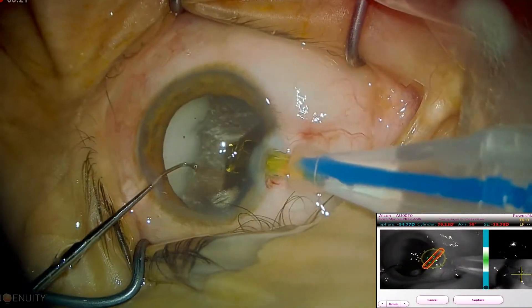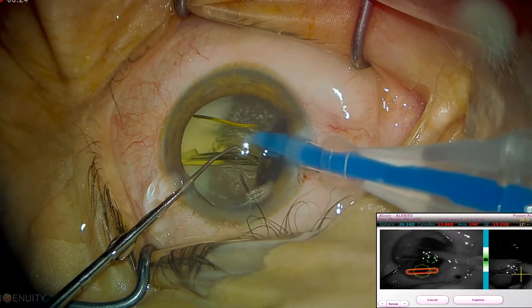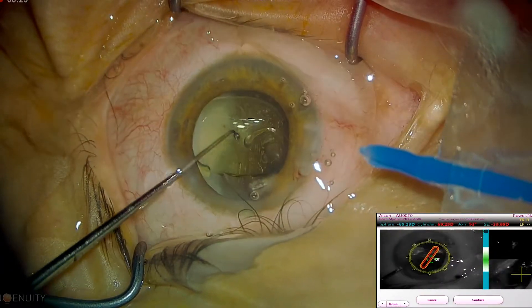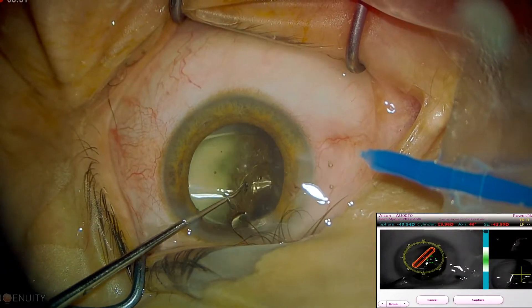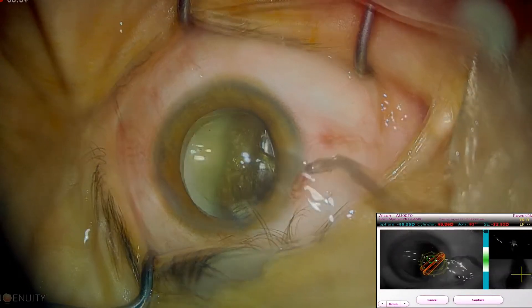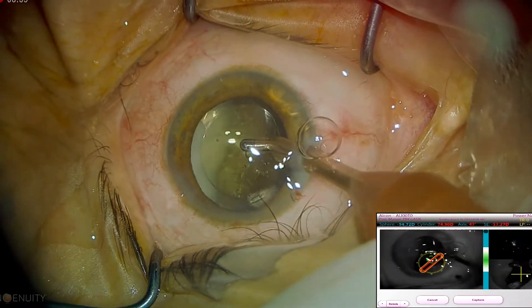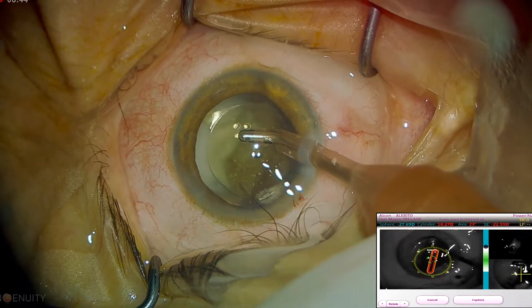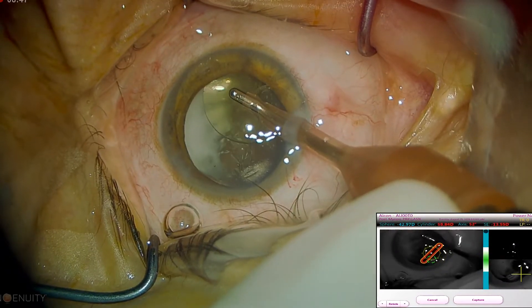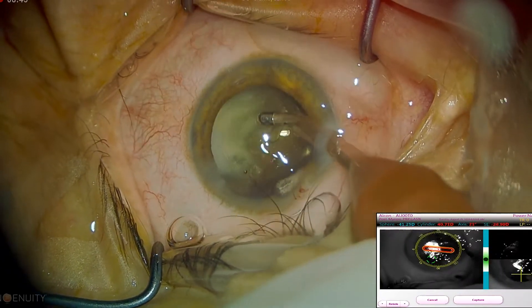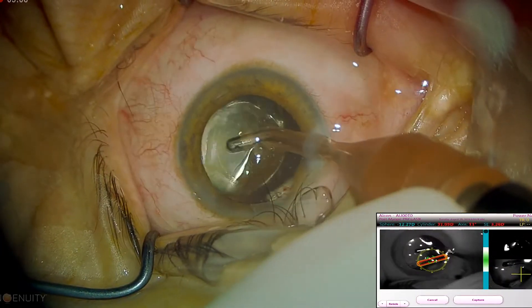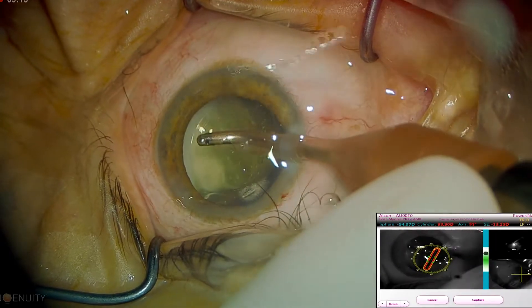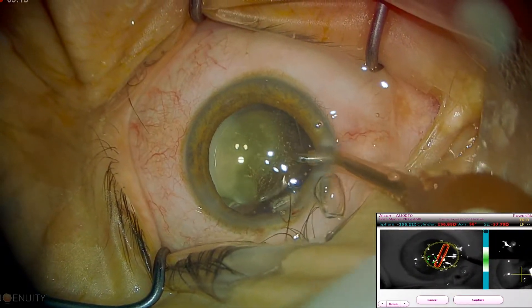The lens implant is injected into the capsular bag and dialed into proper position. Irrigation aspiration is then used to remove the viscoelastic material. The lens is pushed inferiorly and superiorly to try to dislodge any viscoelastic underneath the lens implant. The wounds are then hydrated and the eye is left at physiologic pressure.